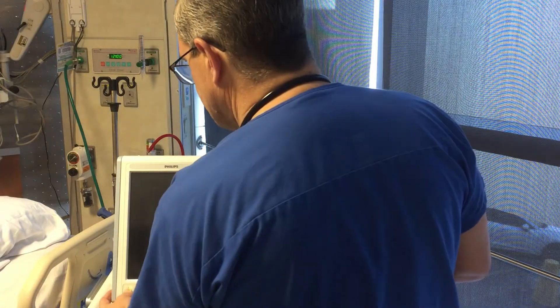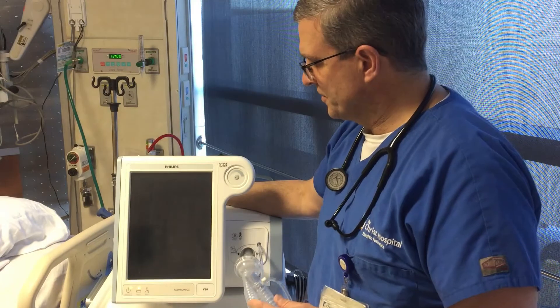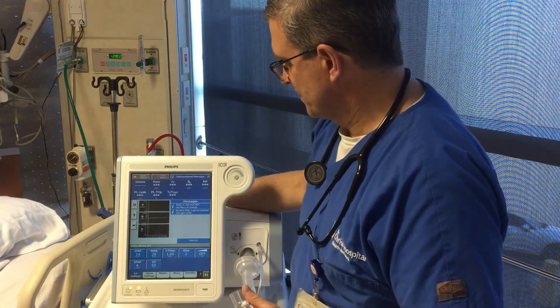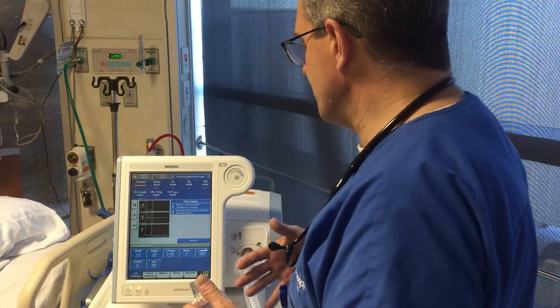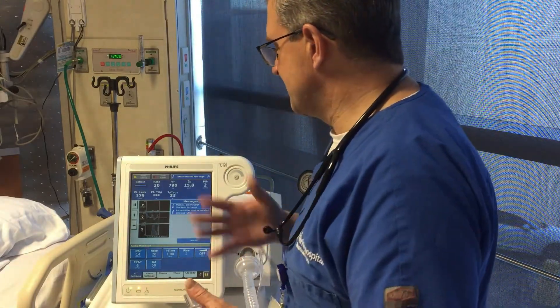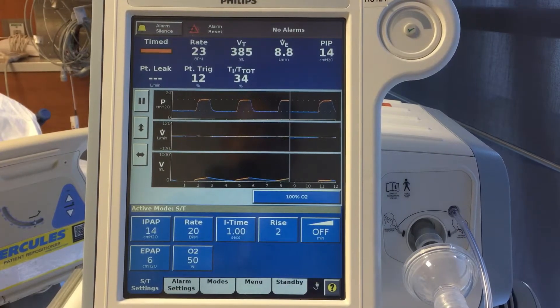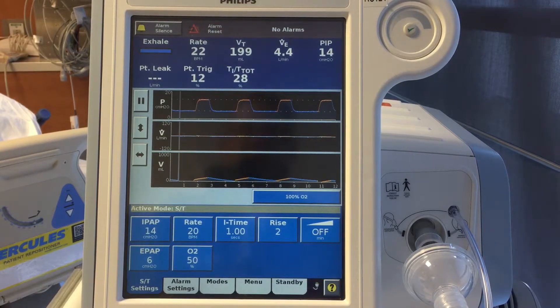Go ahead and turn it on. Go through this start-up procedure — you should always do a leak test, though we're not going to do that today as it differs between machines. So we have our non-invasive system set up, plugged in, circuit on.